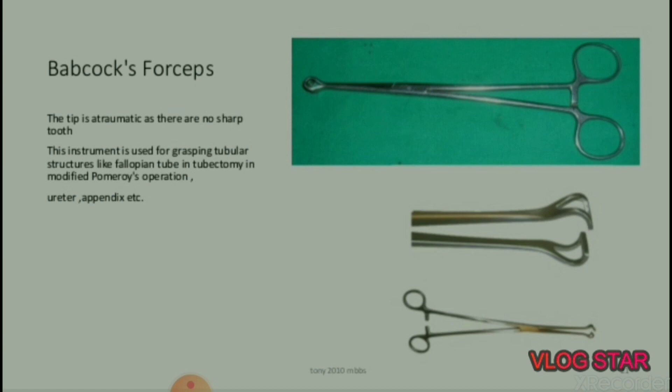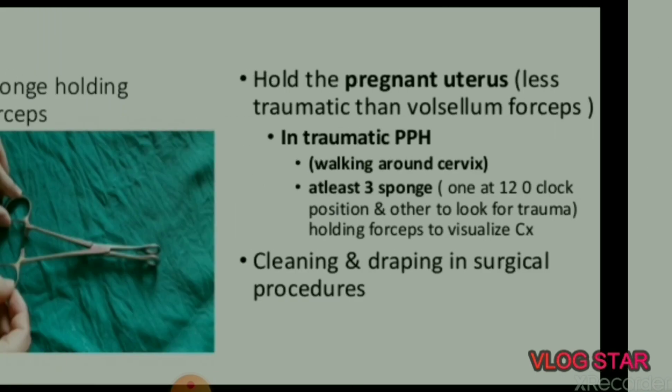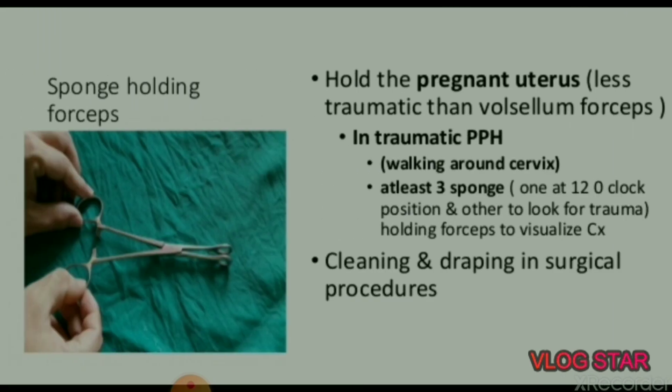Next instrument is Babcock forceps. The tip is atraumatic as there are no sharp teeth. This instrument is used for grasping tubular structures like the fallopian tube in tubectomy in modified Pomeroy's operation, ureter, appendix, etc.